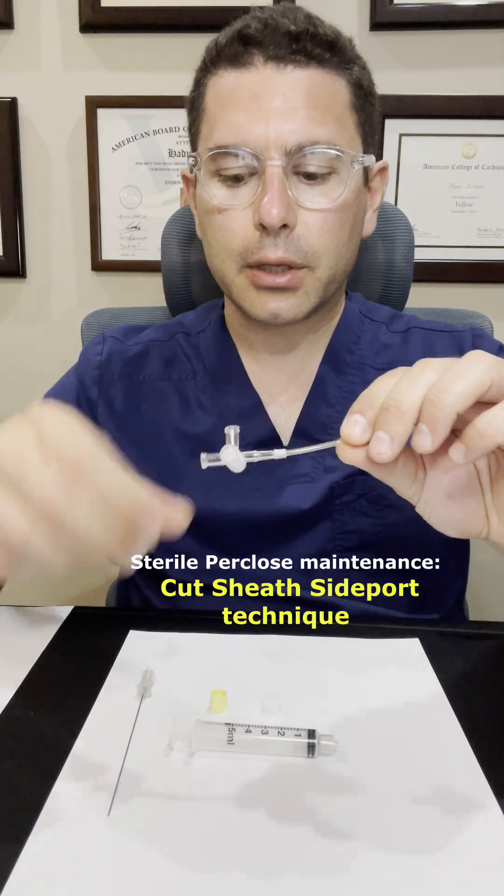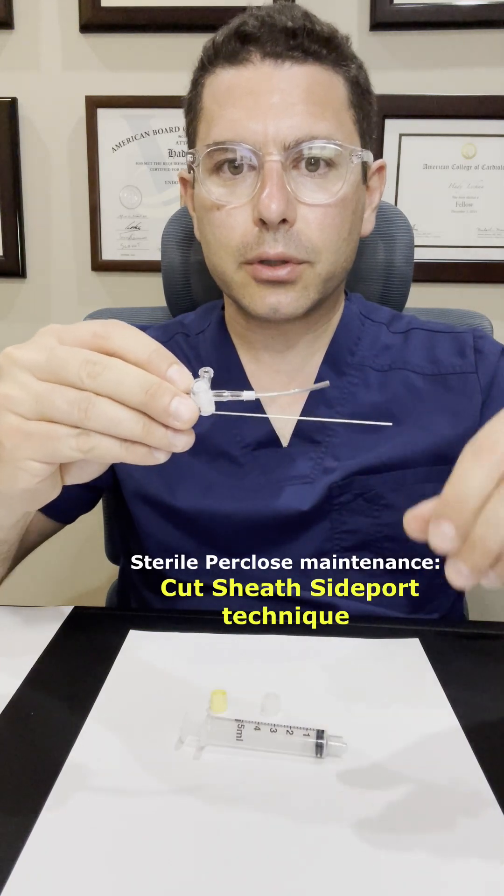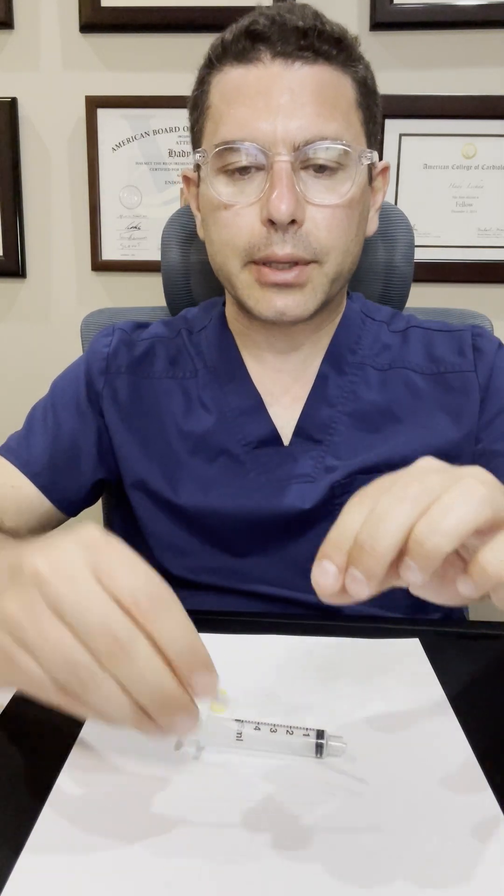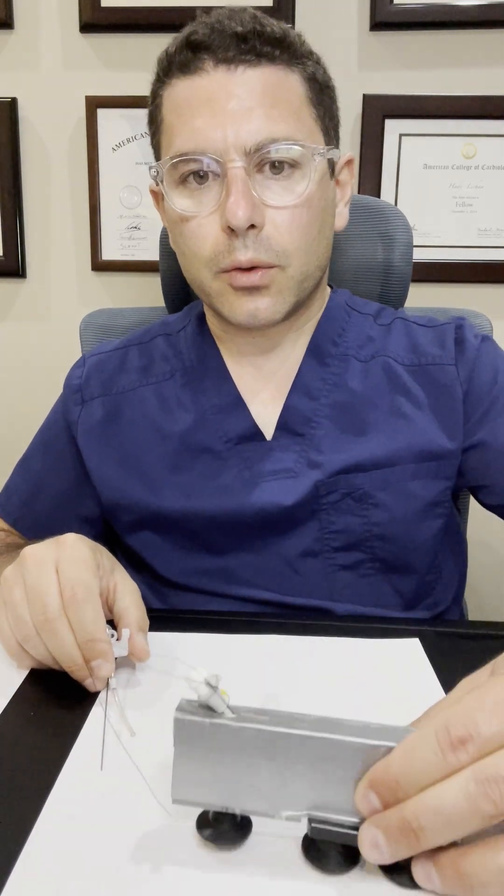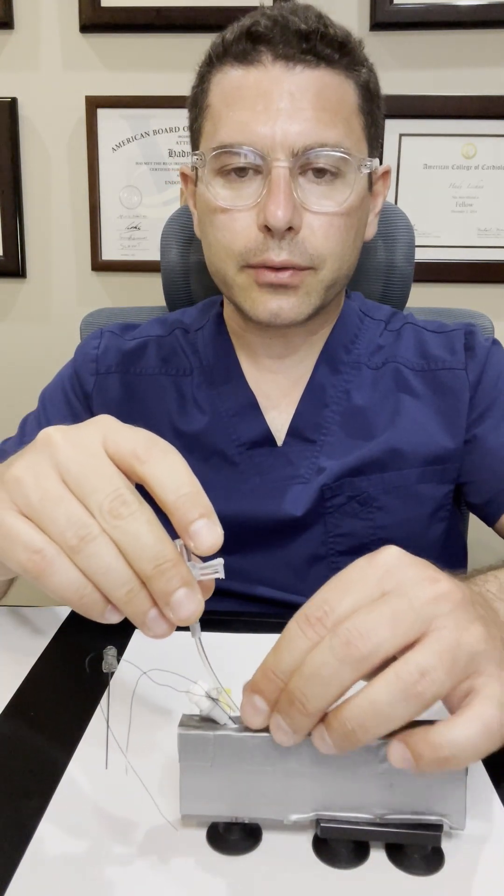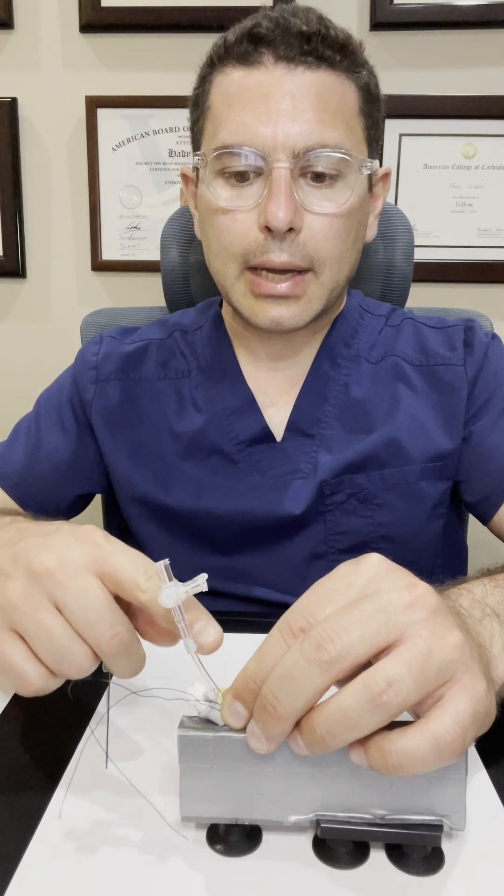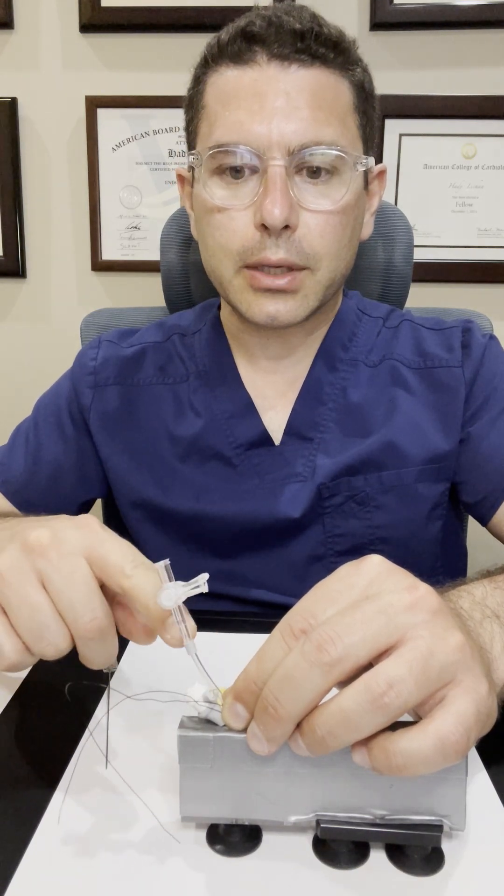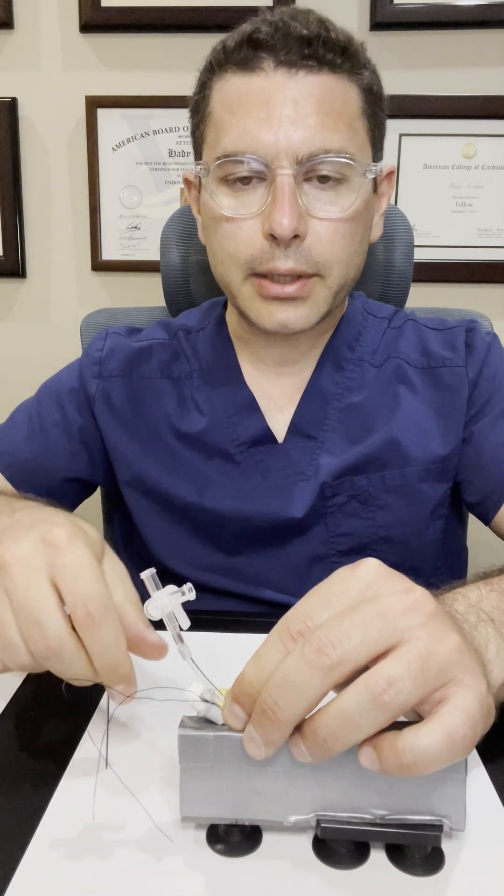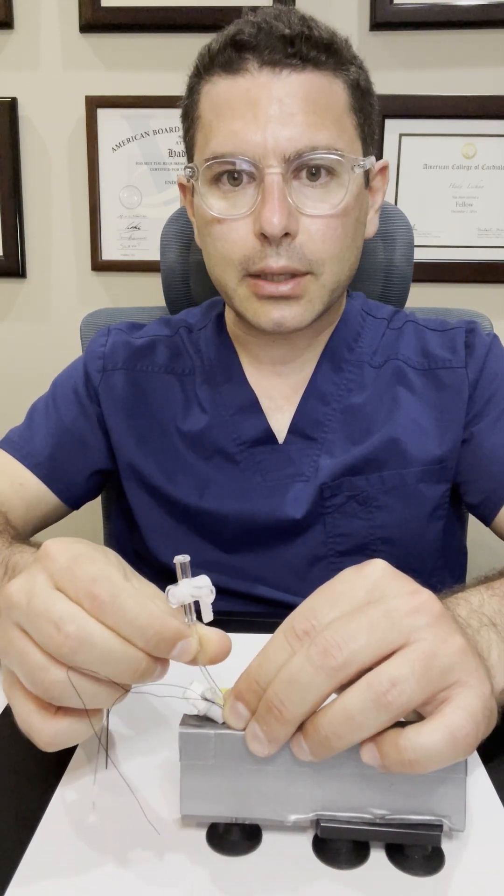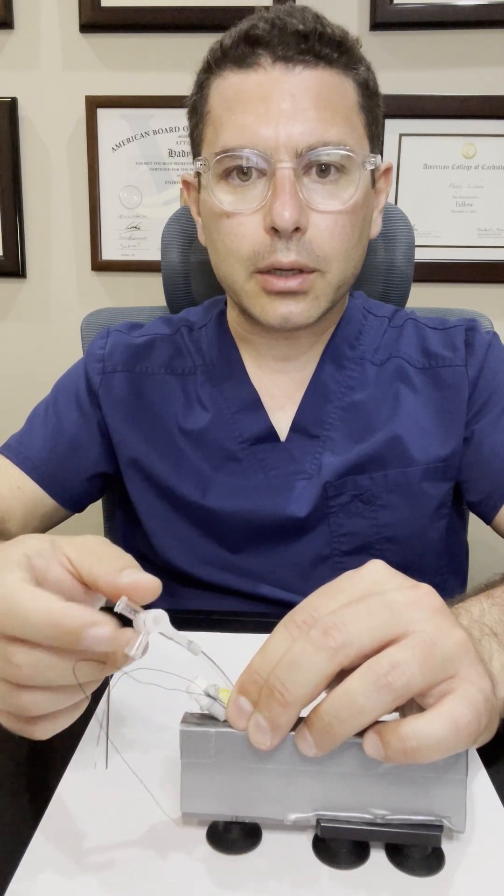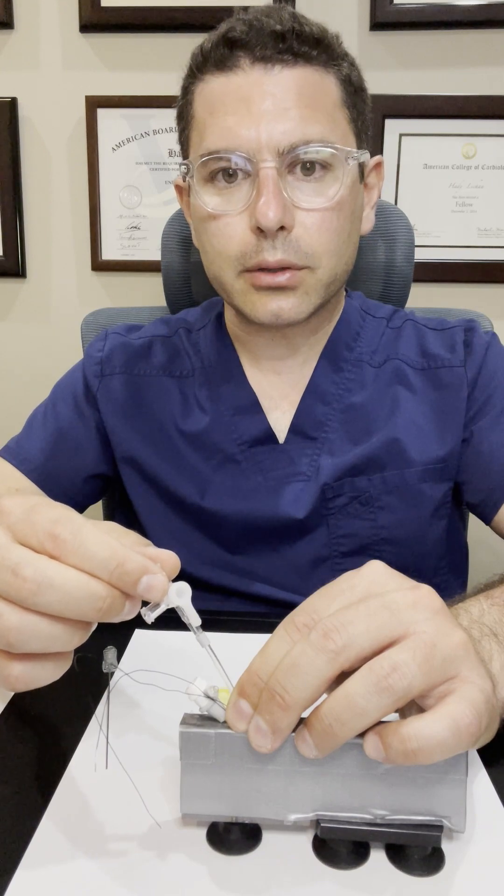Any sheath would be cut in a way that's relatively shorter than a needle introducer. Basically, ultimately that sheath side port is going to be housing those sutures in it, and then the non-locking suture will be locked in place in order to maintain tension on the suture itself and minimize the oozing around the arteriotomy.